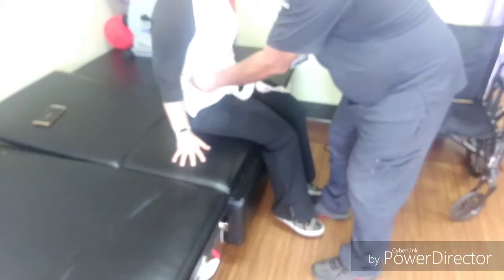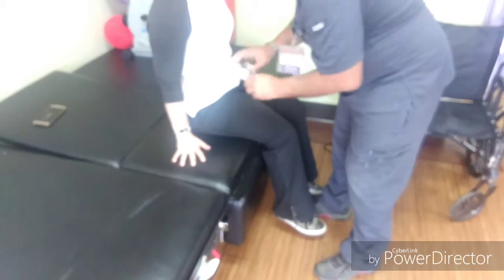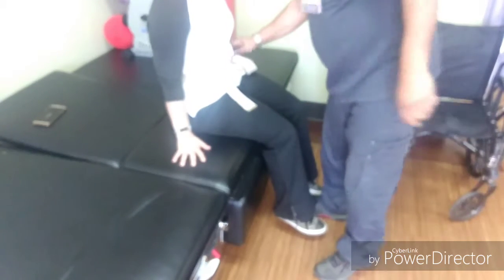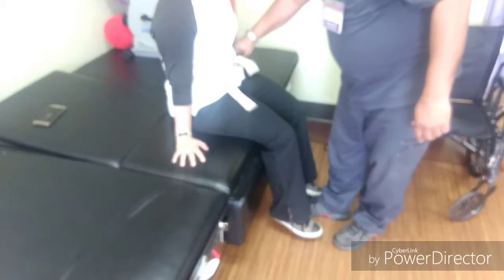Now remember, folks, you only want about 2 fingers of tightness through the gait belt. And then we're just going to thread it through here again so that it doesn't trip you guys up. But you want to just be able to have 2 or 3 fingers through the gait belt, nice and snug. Okay? So here we go.